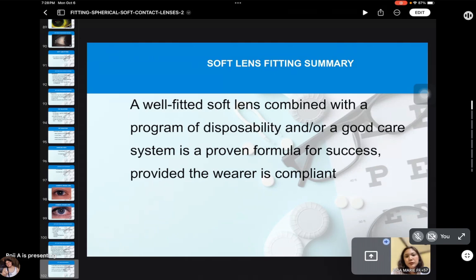And you cannot afford to make it dry up. Even if you soak it again, it will soften again, but the shape is already altered. That's why we don't allow the soft contact lens to dry up in a container. Are we clear? That's why it's always better that you use daily disposables.